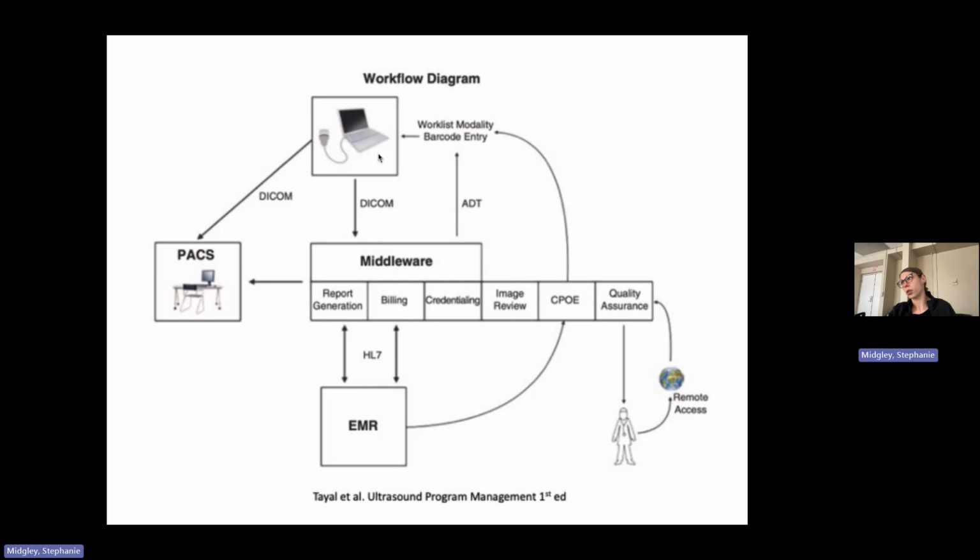So we don't see the radiology ultrasound studies. That's definitely one of the things you need to clarify, because it took a little while for our IT people to realize that ultrasound and POC were not the same thing. So make sure that in the order, there's some distinction for POCUS versus radiology ultrasound. And then from the machine, usually DICOM is how it communicates, and it goes to PACS, and PACS is stored.